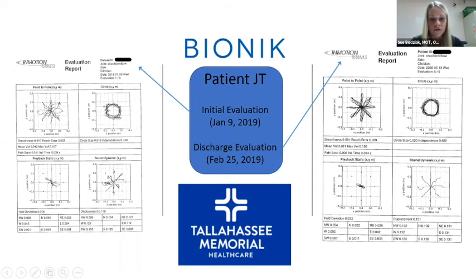I've even used it for lower spinal cord injuries that do have good upper body and upper extremity use, but I use it for their trunk control, using dynamic tall kneeling skills and having them on the floor on a mat, using the robotic arm's stabilization resistance to challenge their balance. So I've even used it that way. There are so many different ways that you can use it.